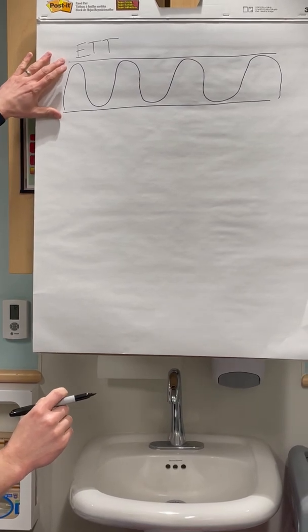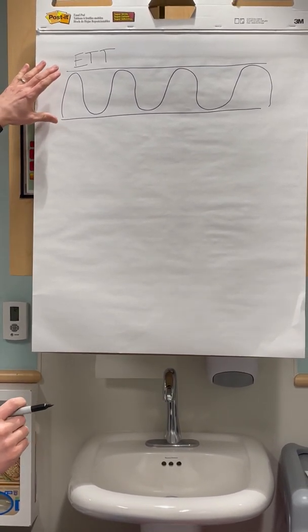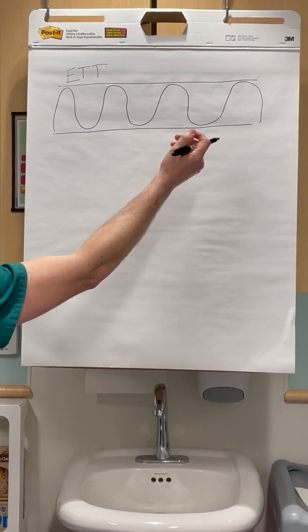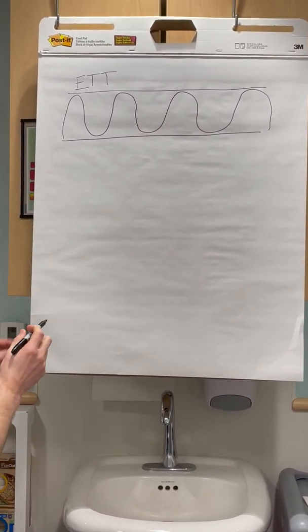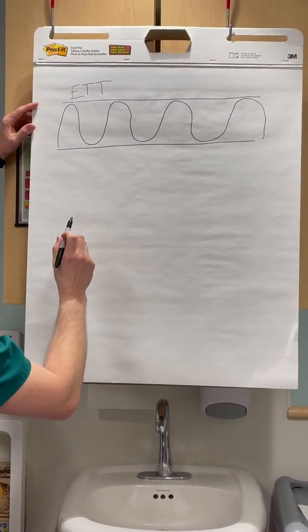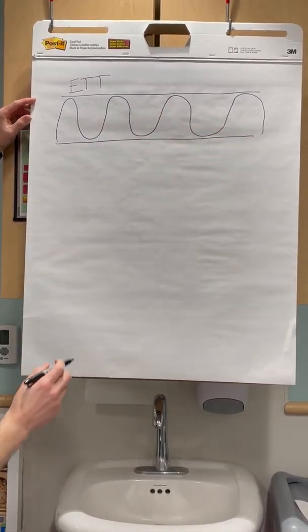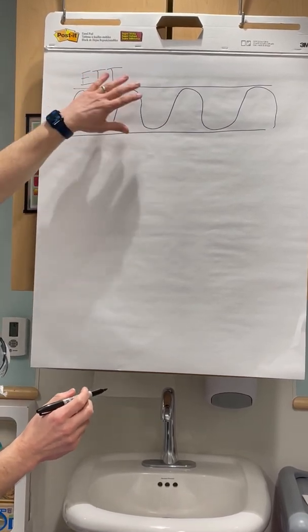So as the oscillator works, it's using small frequency or small breaths being given to the baby, but it's also exchanging and coming back out at the same rate. How I usually describe this is these waves that go up and down are either going to hold oxygen or going to hold CO2.